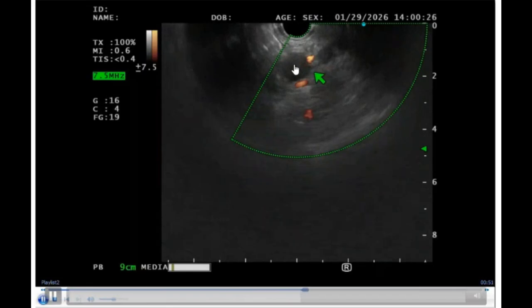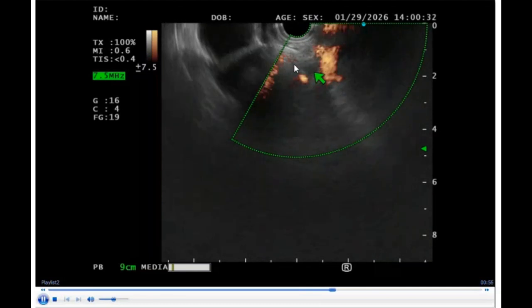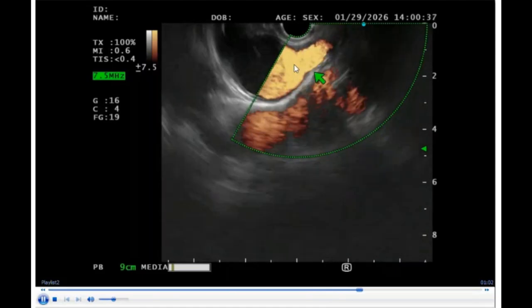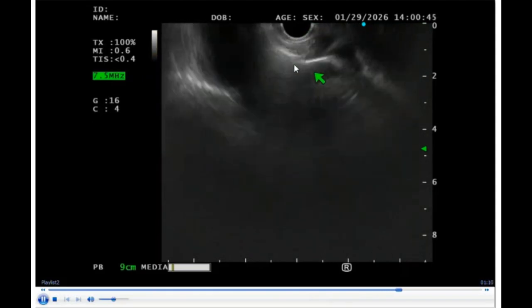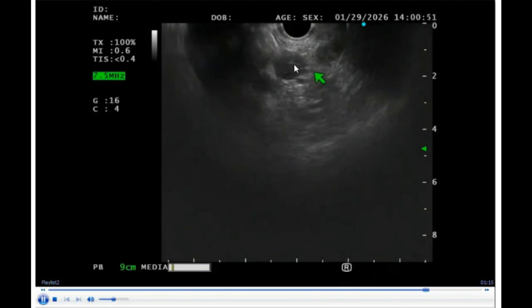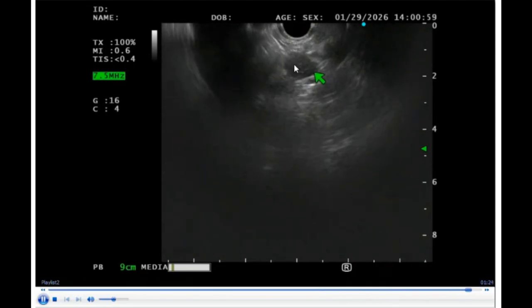So this left carotid kept coming in the way, and the thing with the esophagus is it's mobile, right? And the other thing that I always find interesting between the conventional EUS scope and the EBUS is you can move the esophagus much better with the conventional EUS scope, because of the stability, and it's a larger scope. So you're able to get that window by moving the esophagus a little bit more than what you can achieve with the EBUS scope in the esophagus. Here, we moved the esophagus a little to a window where I could see this lymph node and biopsy it here.